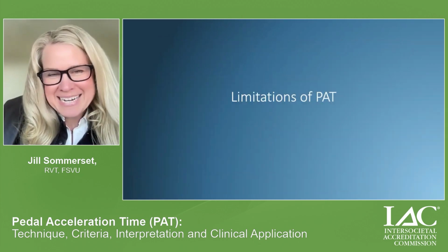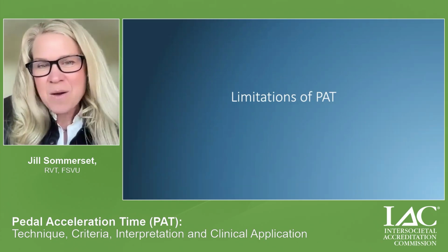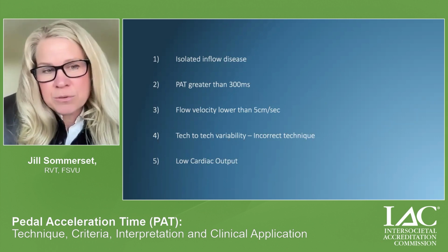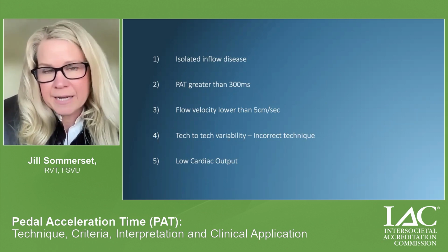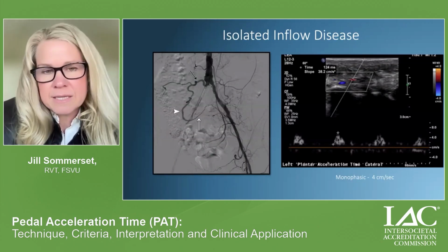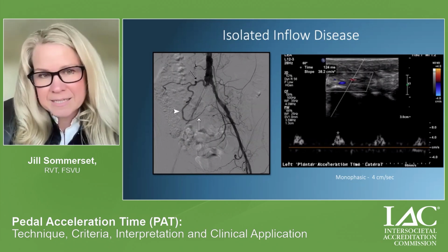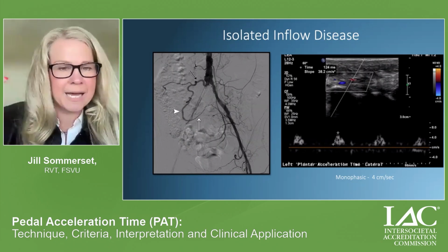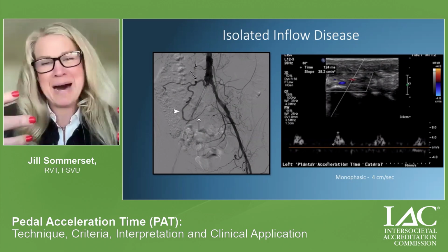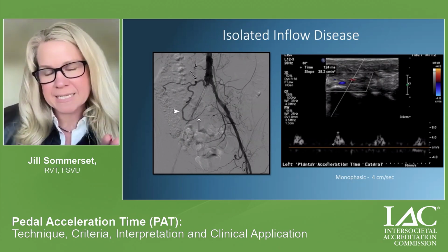Nothing is perfect. And so we spent a long time poking holes in our own theory. So we need to understand where the limitations of this technique are. And I'm going to go through 5, which I think are important to recognize. The first is in the setting of significant hemodynamic inflow disease that's isolated. So common iliac artery occlusion, high-grade external iliac artery stenosis, even a common femoral artery that's a rock pile with a high-grade stenosis. But everything below that is widely patent.